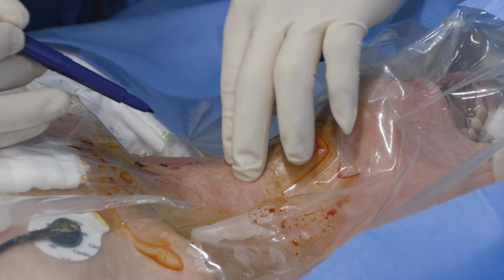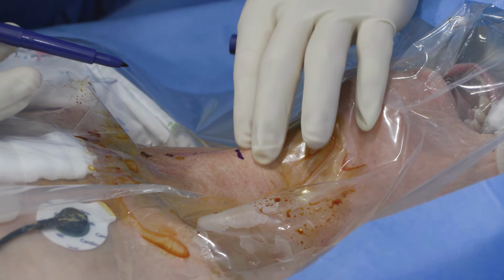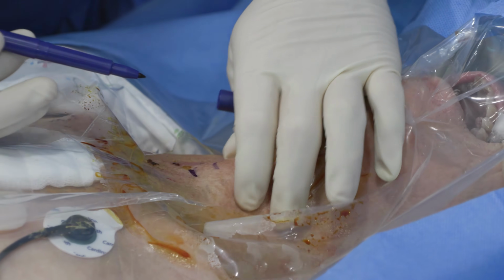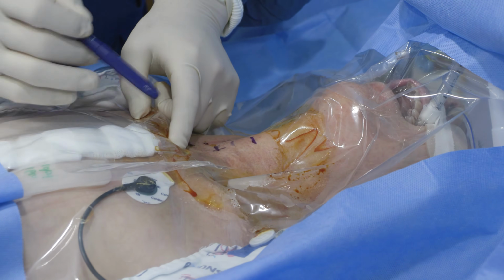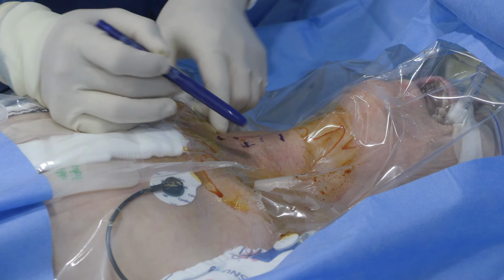From the top, identify the thyroid cartilage, cricothyroid membrane, and cricoid cartilage in sequence. The usual puncture site for PDT is between the second and third tracheal rings, just below the cricoid cartilage. Palpate the area carefully, confirm the midline, and mark the site.